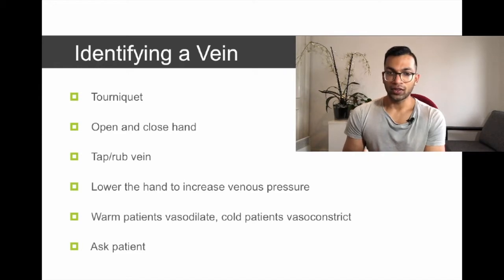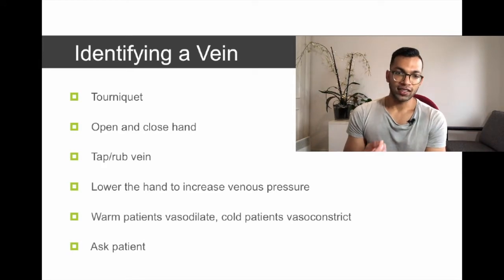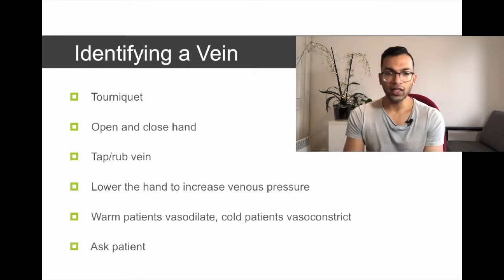Other people also talk about tapping and rubbing a vein. Just make sure you don't do this so that it actually hurts the patient. But what it actually does is tapping and rubbing the vein releases vasoactive mediators, and these can cause a dilation of the vein itself. One of the things that I find really useful is to lower the patient's hand.